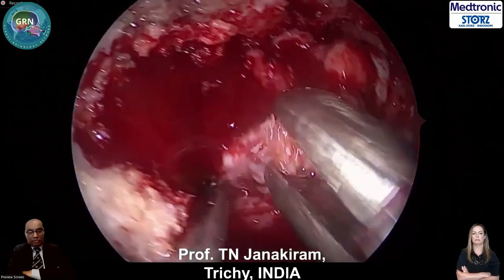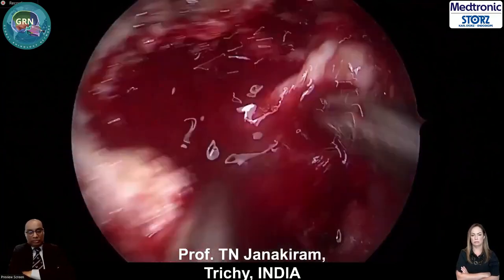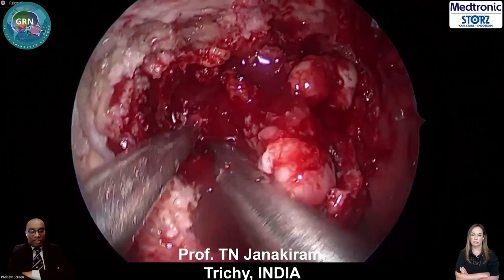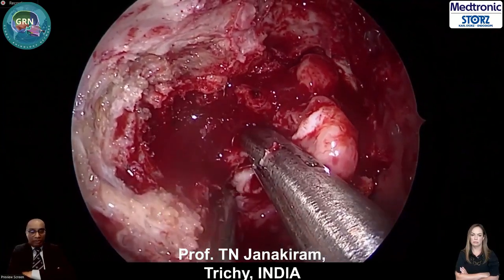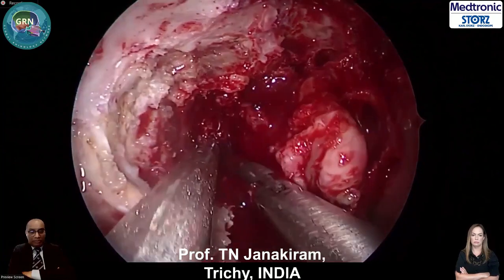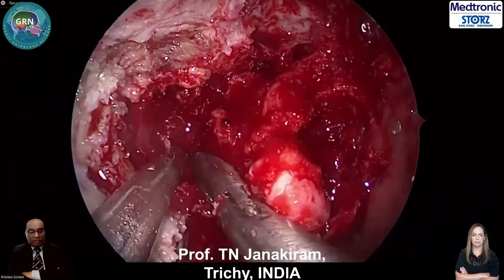That is peeling off from the nasopharynx. So you're gradually advancing your grip on the tumor and just gently pulling it out, correct? Yeah, embolization and all will not work. Embolization doesn't embolize this venous plexus. So you have to live with it. See the black blood. Yes. It is venous blood.